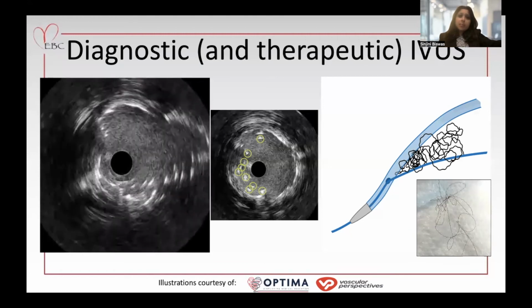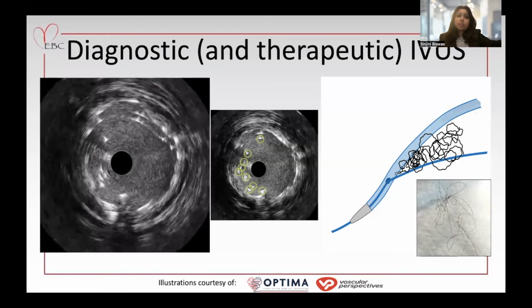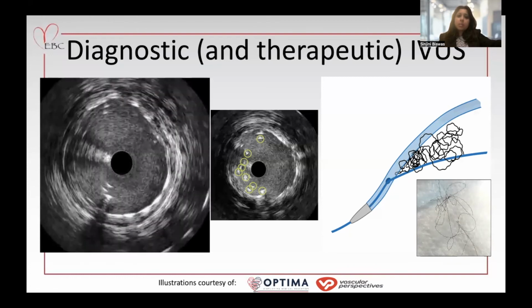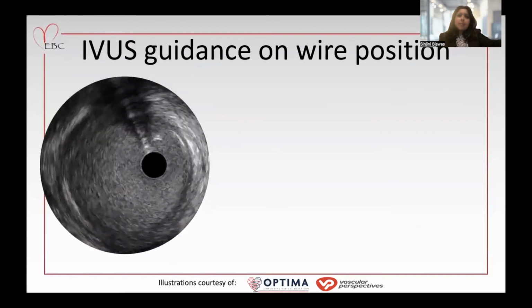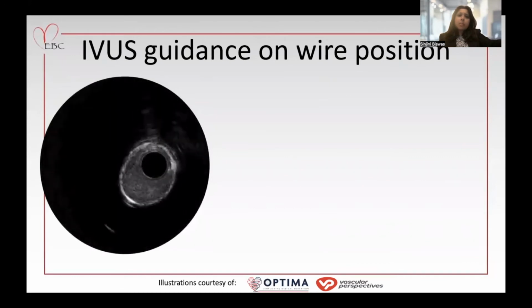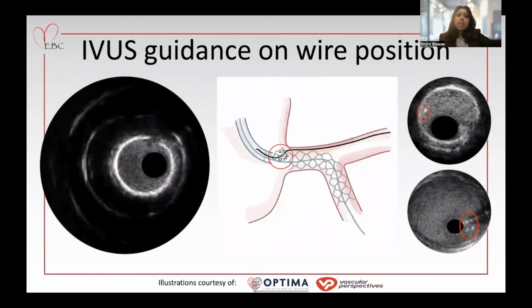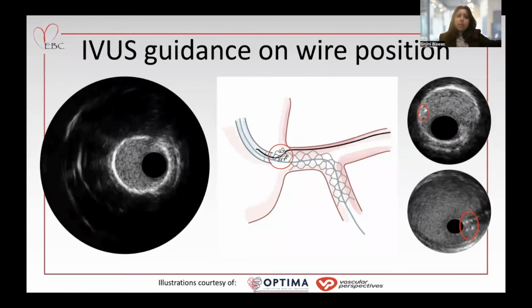And so we did that a few times, and every time the repeat IVUS images showed fewer and fewer filaments, and every time we got out all this hair-like material caught between the IVUS and the wire. And so we thought that's a win. And then we did the IVUS again, and I've truncated the run, but hopefully you can see that there are still some filaments in the left main, and filaments going back into the guide, which I've just highlighted here. So now we have confirmation that the wire has definitely fractured somewhere in the guide.